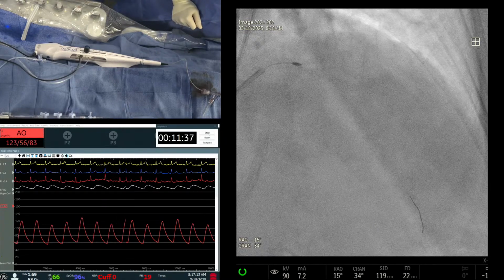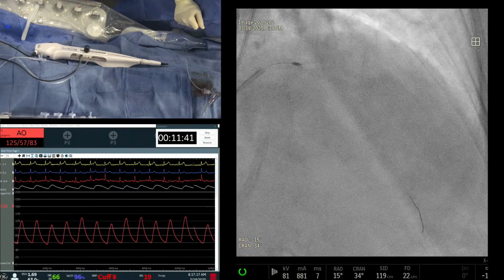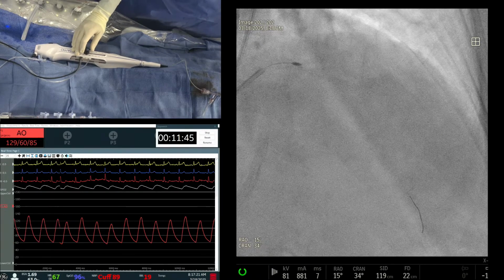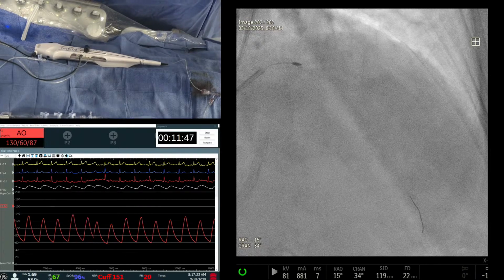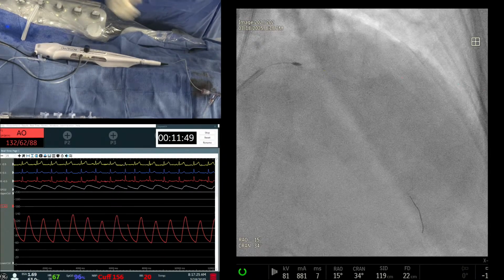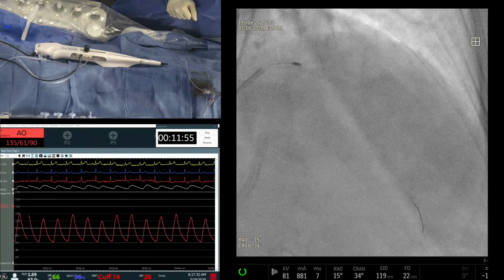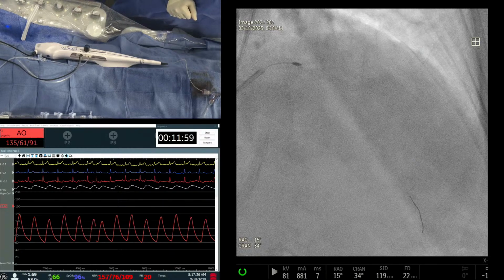The other question is two things. One, as mentioned, you don't have to have a full ablation; your partial ablation is good enough. And the second is that you can go with a higher speed. Because we are at 145, you can go to 160, because ablation efficiency goes down at the lower speed. It is better in terms of slow flow and perforations, but ablation efficiency goes down.